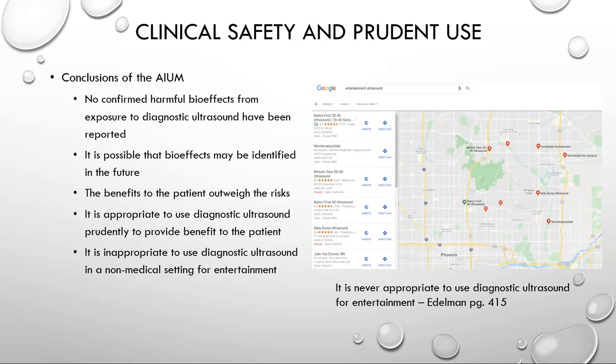Clinical safety and prudent use of ultrasound. Conclusions of the AIUM state that no confirmed harmful bioeffects from exposure to diagnostic ultrasound have been reported. It's possible that bioeffects may be identified in the future. However, the benefits to the patient currently outweigh the risks. It's totally appropriate to use diagnostic ultrasound prudently to provide a benefit to the patient. It's inappropriate to use diagnostic ultrasound in a non-medical setting for entertainment. However, when we look at a quick Google search, we see many sites set up to do ultrasound just for entertainment.